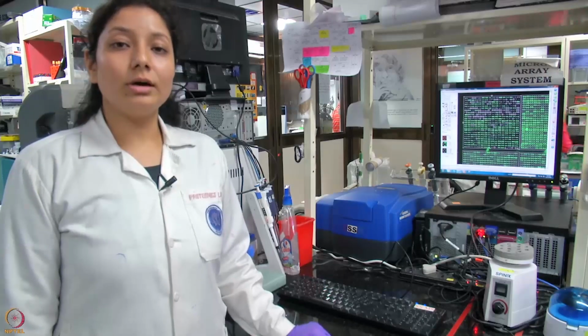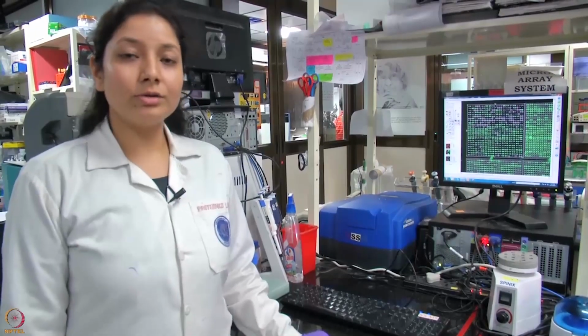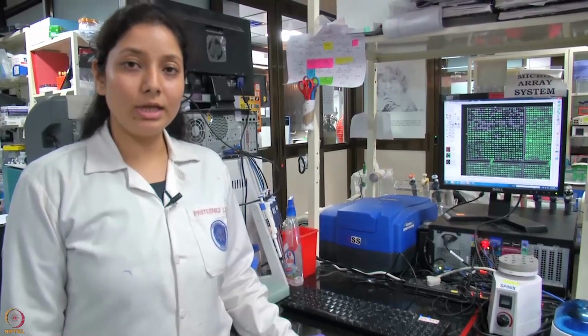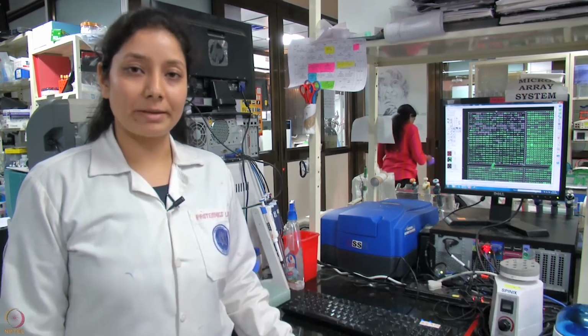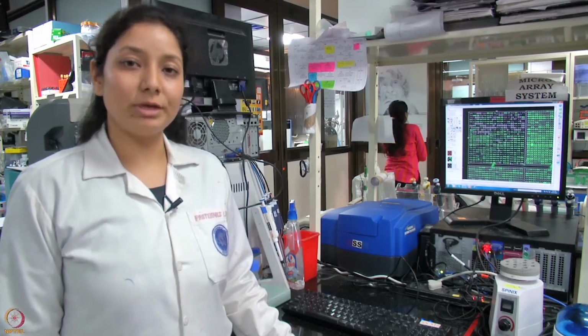Hope you have got a basic feel of how the microarray experiment is performed to detect the presence of autoantibody in cancer patients. So this is one of the applications of protein microarray, which can be used to screen multiple proteins using a very small amount of patient sample, and to detect the abnormalities in the patients. Thank you.